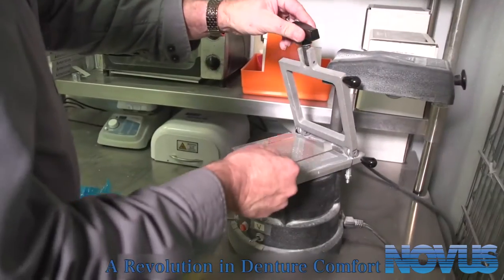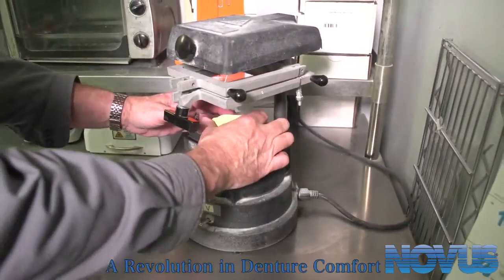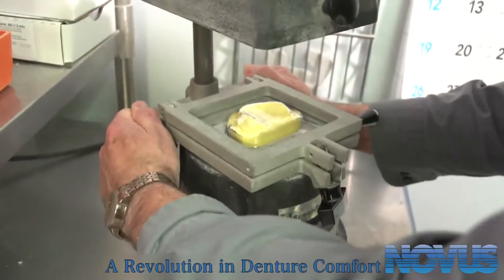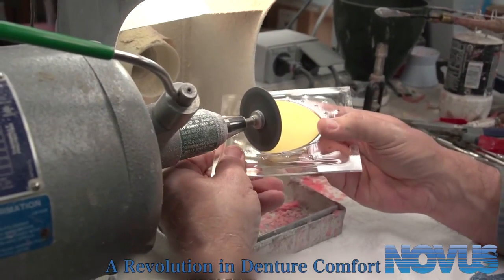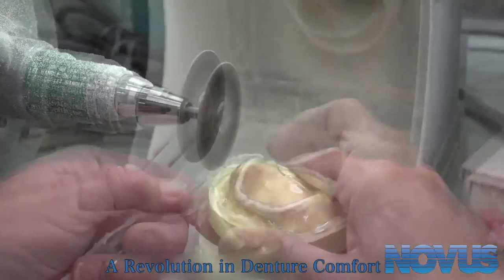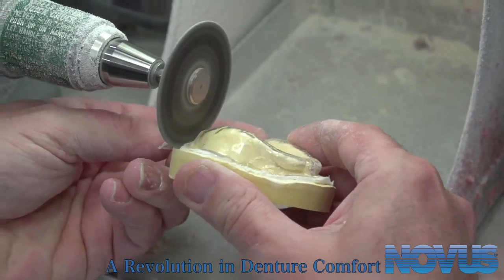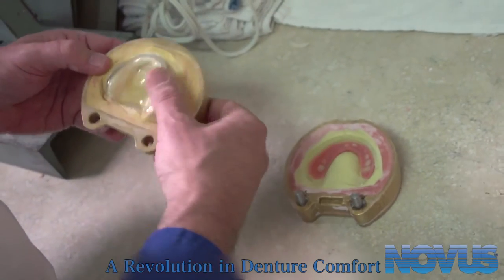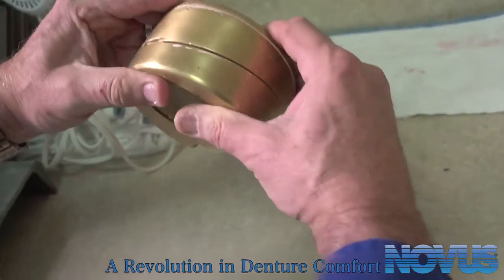Now, prepare a spacer on the cast. Adjust the spacer and what is remaining of the denture until both halves of the flask close with no interference.